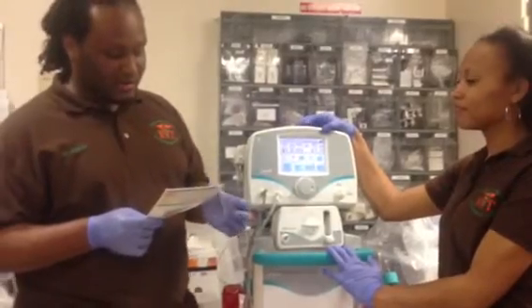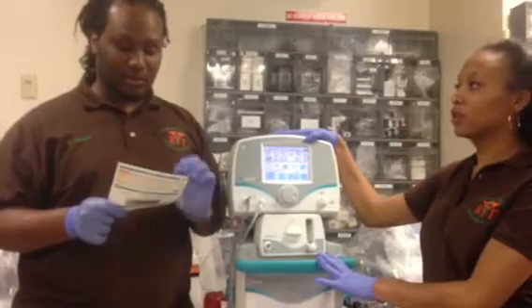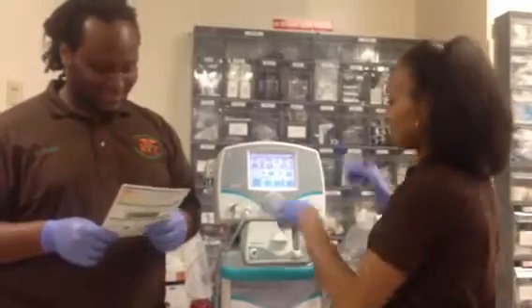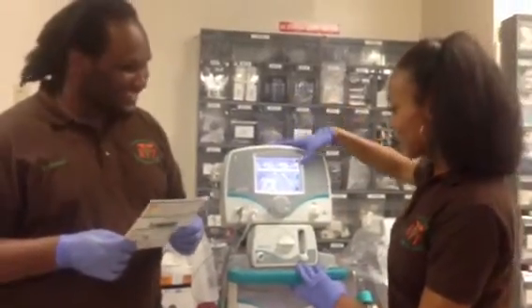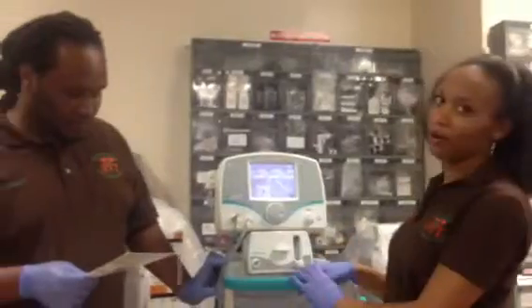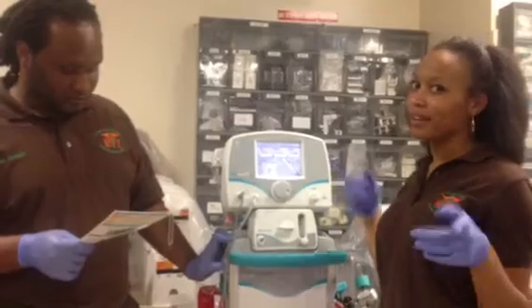Now we wait 30 seconds and the pressure hasn't dropped. We're going to perform our low-calibration test on this. Then we're going to press the low-cal again, and now this is going to calibrate that part. And once all three of these portions right here turn green, that means that it is calibrated.